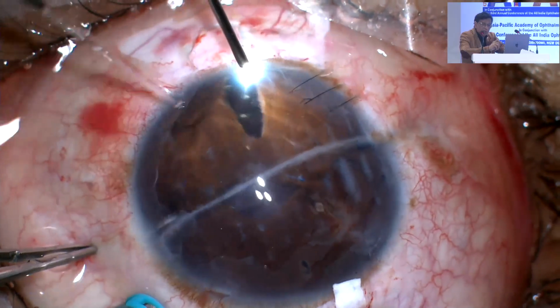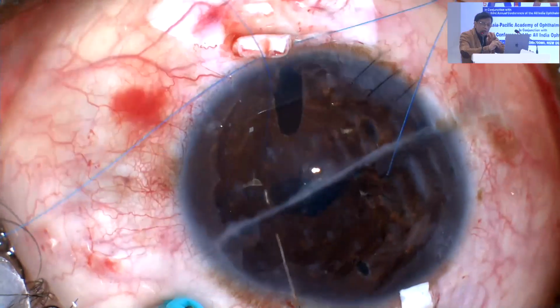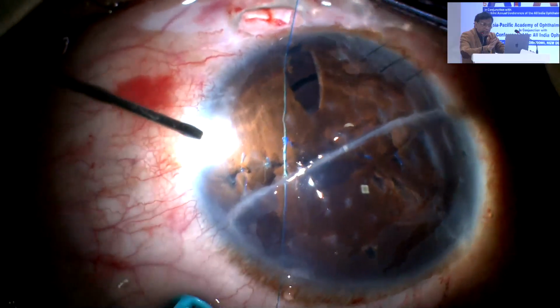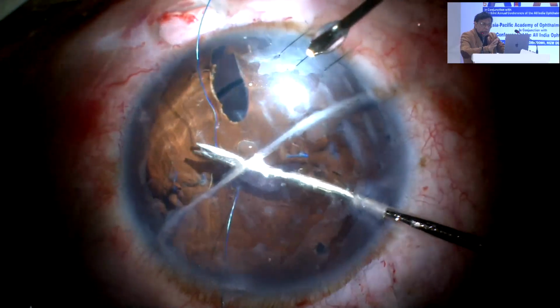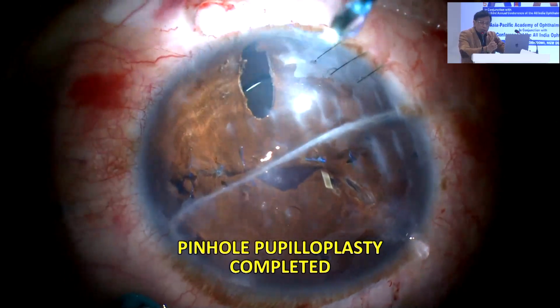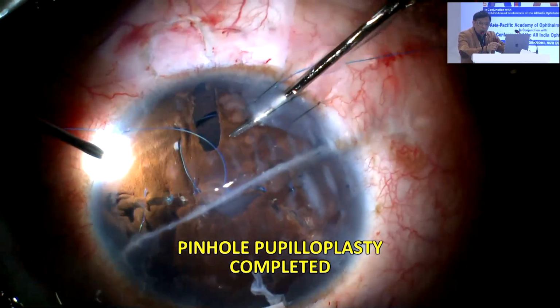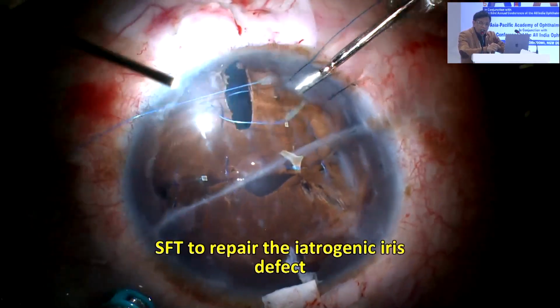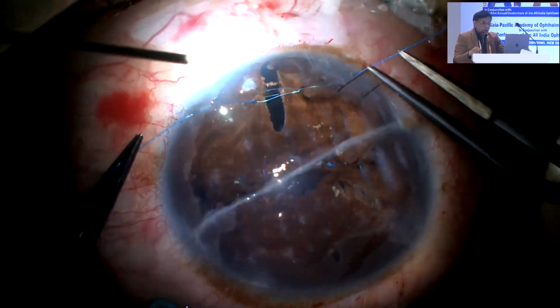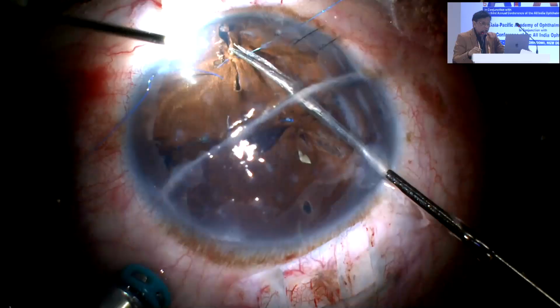Now, remember the step here is you need to have a vitrectomy probe. All your phaco machines have got very good vitrectomy probes. I tend to use the posterior vitrectomy system, being a retina person, but you can always use your phaco vitrectomy machines also with it. That small peripheral iridectomy had become large because I have pulled on that iris. That also gets closed because I don't want this patient to have any polycoria, things like that.